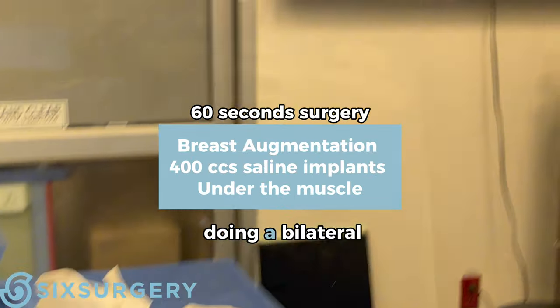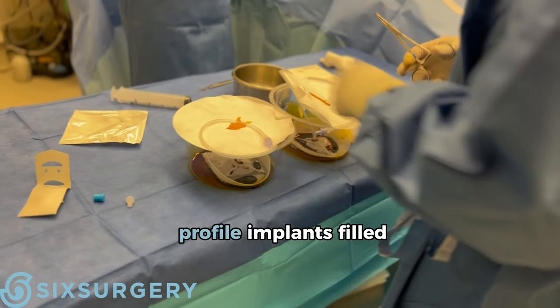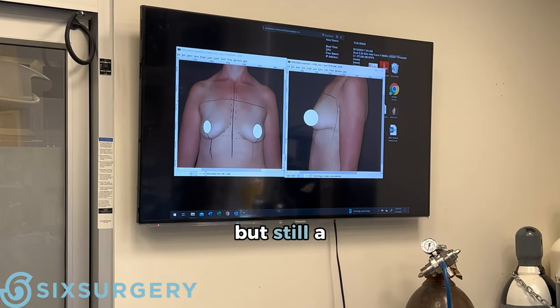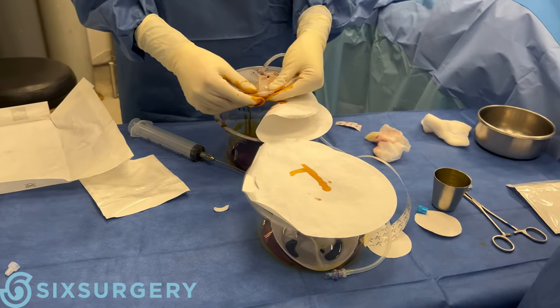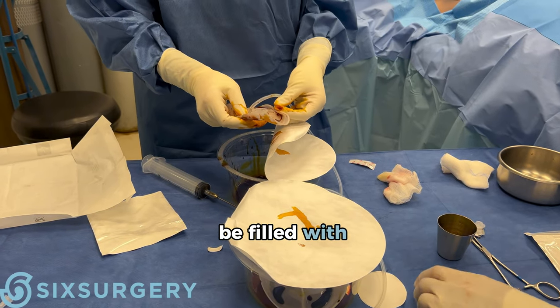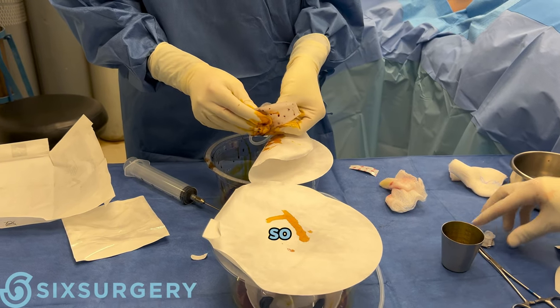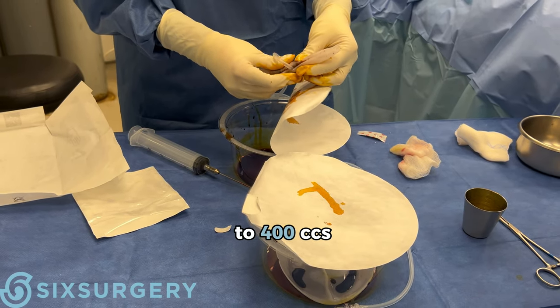For our next case we're going to be doing a bilateral breast augmentation. We're going to be using saline implants — these are high profile implants filled to 400 cc, so a nice elegant proportional look but still a high profile shape. This is a silicone shell that will be filled with saline, and we do overfill a little bit to prevent palpable wrinkling. This is a 350 cc shell and we're going to overfill it to 400 cc.